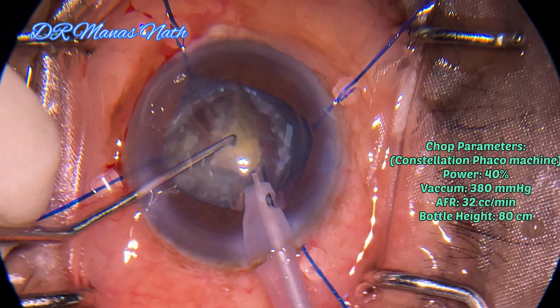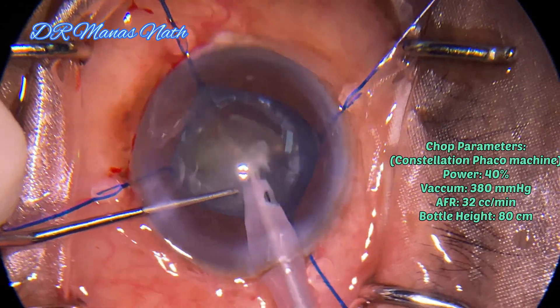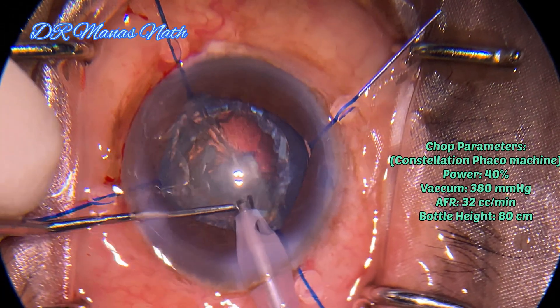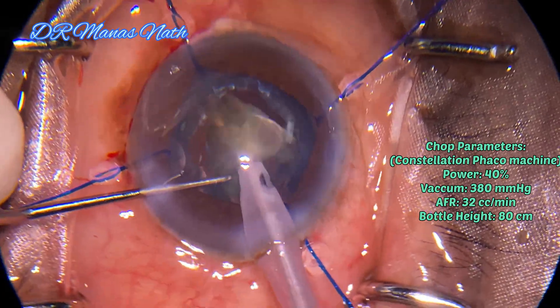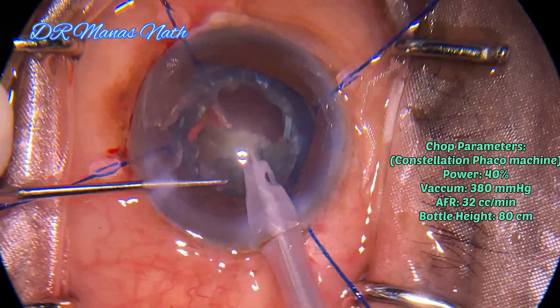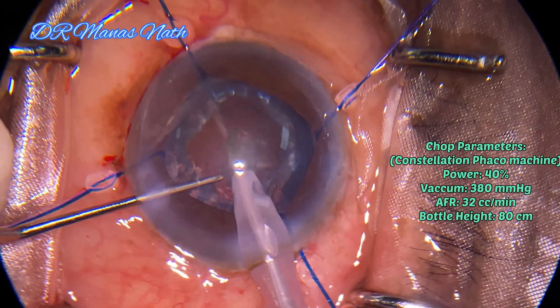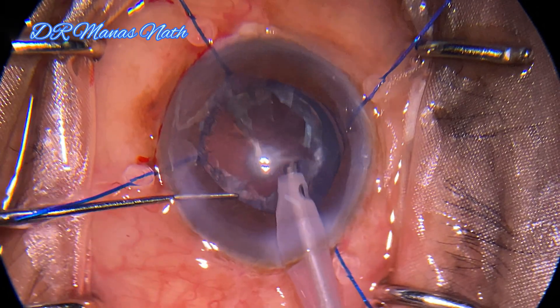The remaining nucleus can be prolapsed out with the help of a Sinskey hook and emulsified. Now taking out the epinucleus.